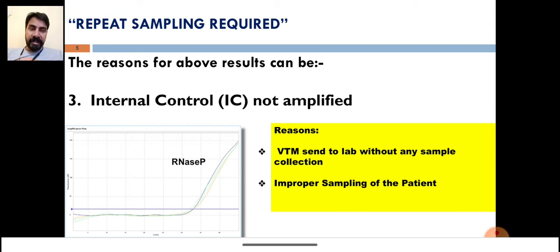If internal control is not amplified, then the labs are not able to give your result as positive or negative. What are the reasons IC is not amplified? It might be possible that improper sampling of the patient was done by some unprofessional technical staff who have no idea how to collect the sample.